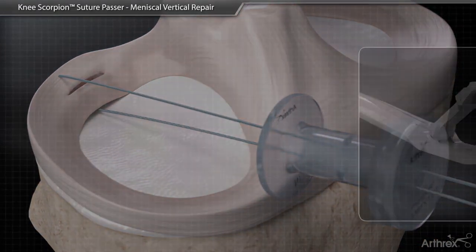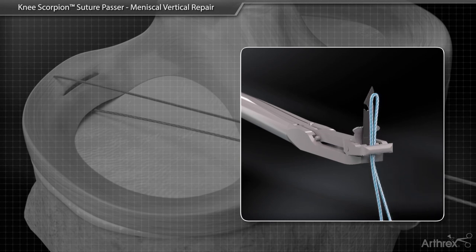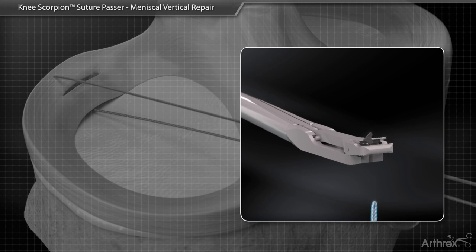Remove the suture from the Knee Scorpion by closing the jaw and advancing the needle. While the needle is deployed, remove the suture.